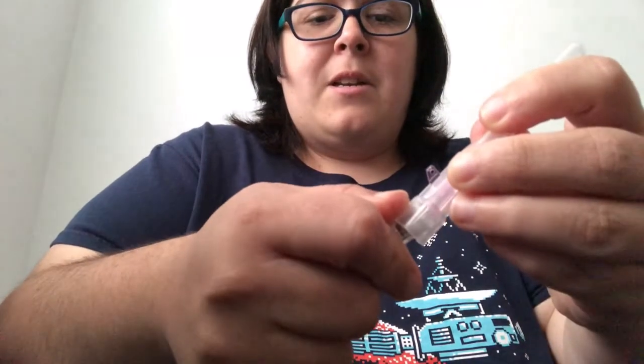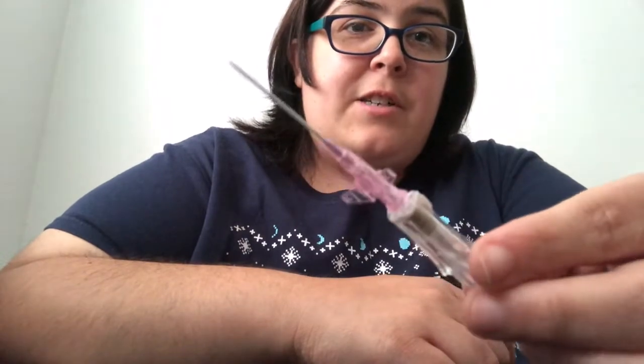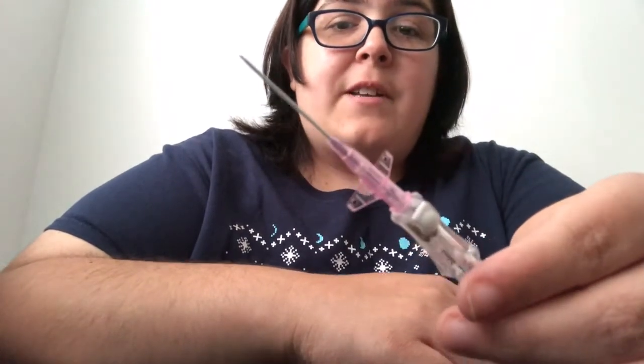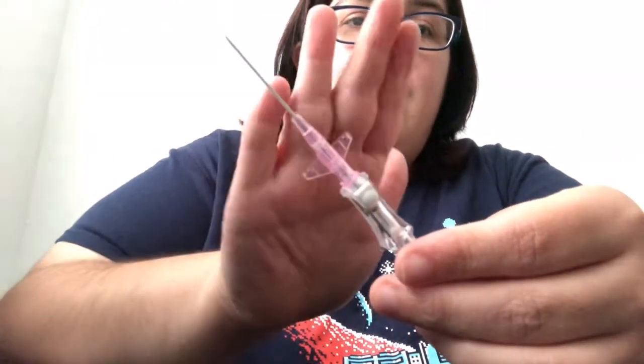Please don't hit the button. Okay, so this is the needle. You can see this is a larger needle. This is for starting IVs, and this actually has the little wings on it, if you can see that.